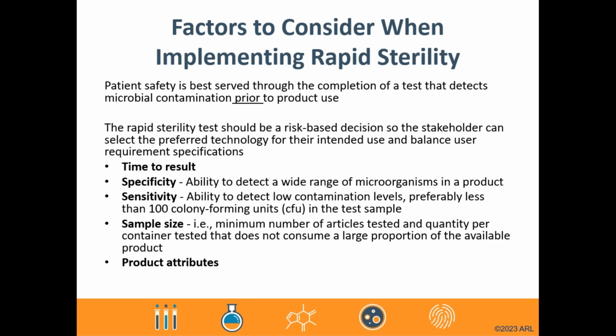The next slides cover some important things to consider when deciding if rapid sterility testing is right for you. First and foremost, it's always important to remember that patient safety is best served by detecting any microbial contamination prior to a product's administration. Ultimately, in order to determine if a rapid sterility test is right for you, and further what methodology meets your needs, several factors play into that decision.